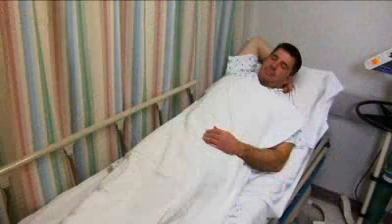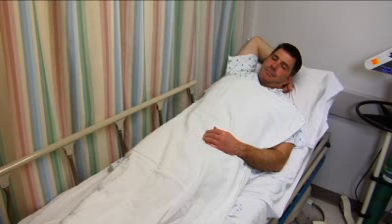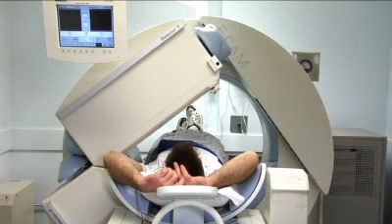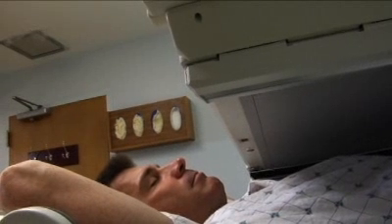After stopping exercise, you will continue to be monitored until your heart rate and blood pressure return to pre-exercise levels. Finally, you will lie back down on the scanning table to be imaged by the gamma camera for another 20 minutes.